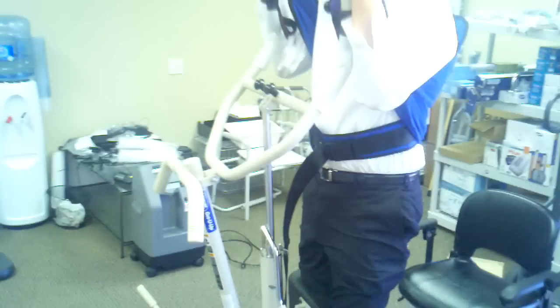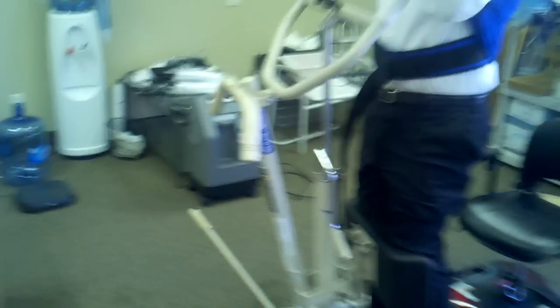If this were a full patient lift, like a Hoyer lift, the sling would be in this area here and it would be holding him — and it works just like a standard Hoyer lift. You can see he's fully stood up in the lift, weighs about 250 pounds, and it does have a 300 pound weight capacity. Are you comfortable? I am.